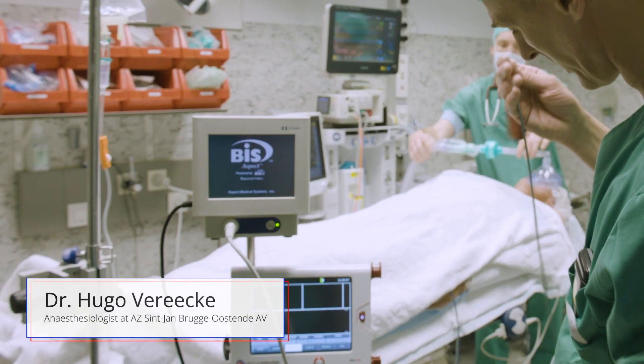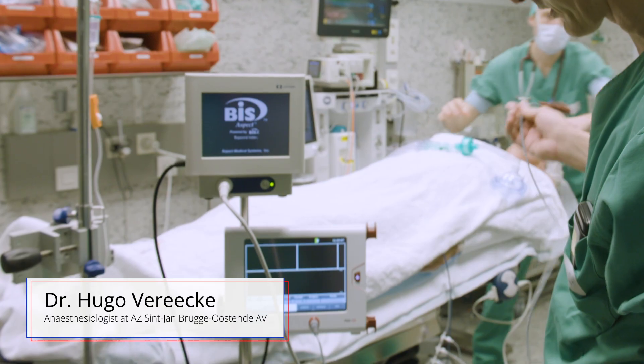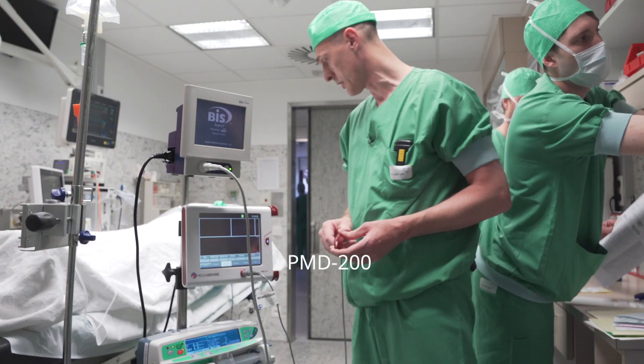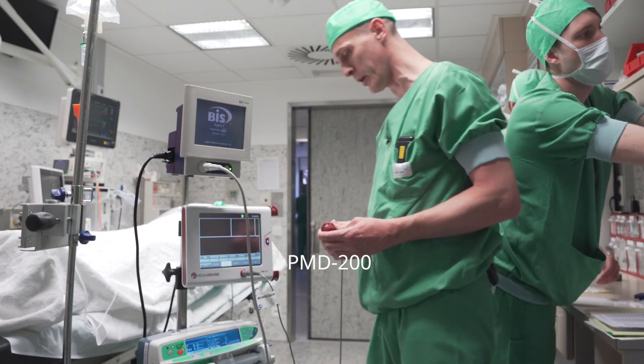This is my nociception level monitor to titrate my drugs, mainly my opioids.